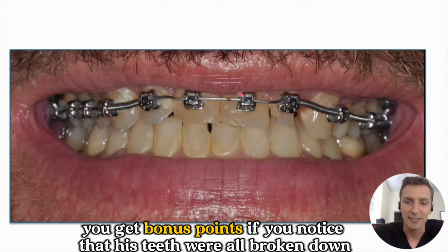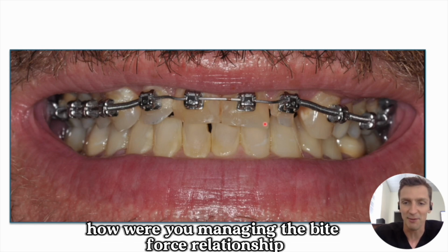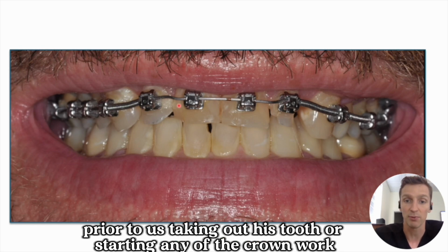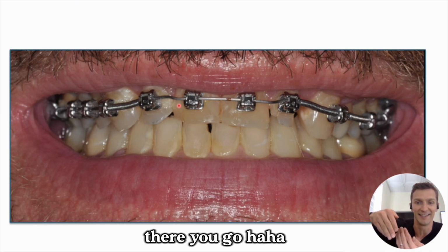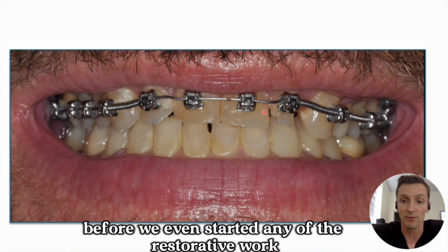By the way, you get bonus points if you notice that his teeth were all broken down and you were wondering, well, how were you managing the bite force relationship? And this is how. We actually did some orthodontics prior to us taking out his tooth or starting any of the crown work, just to create space between the bottom teeth and the top teeth. It's kind of hard to show you. There you go. Okay, so he did a round of orthodontics before we even started any of the restorative work.